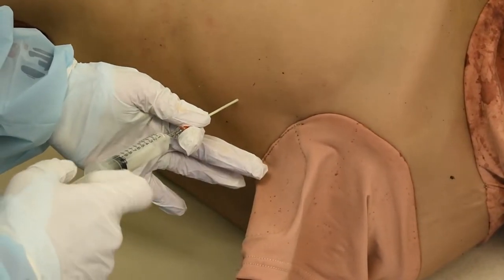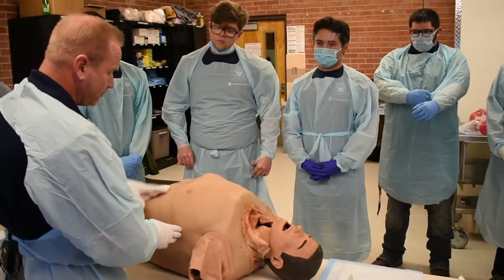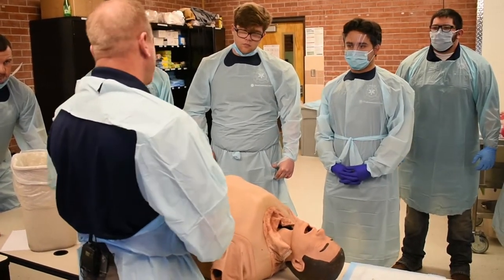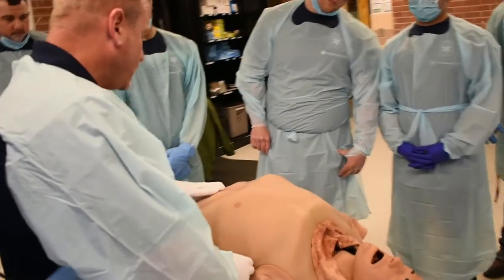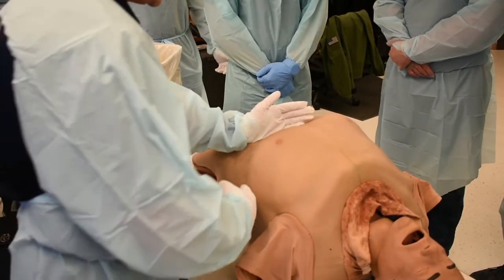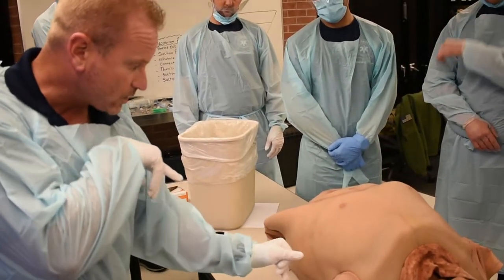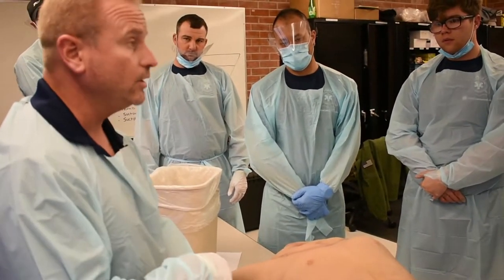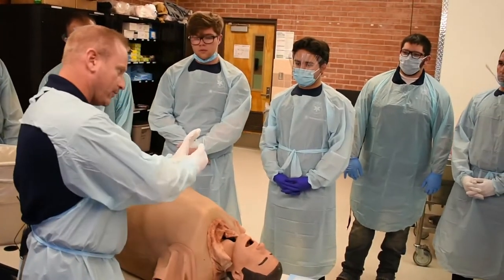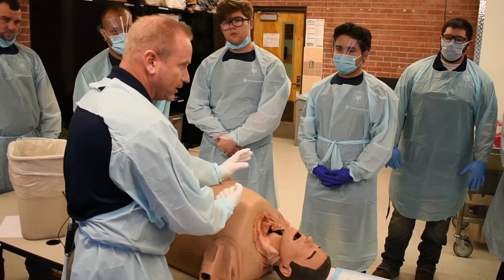If it's a term pregnant patient — say an MVA, crush injury, and she's term — we just move up one rib space: third or fourth intercostal space, and you're not going to hit the baby. As she's term and her fundus is pushing up on all structures, it pushes up on her diaphragm. You want to stay at third or fourth so you don't inadvertently put your needle through the diaphragm. On the left side, if you angle down, you could hit the spleen. On the right side, you could go through the liver — you'd think it was a really bad hemothorax but you've actually punctured the liver.